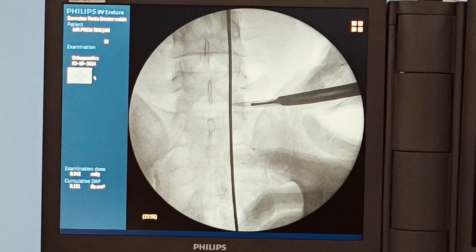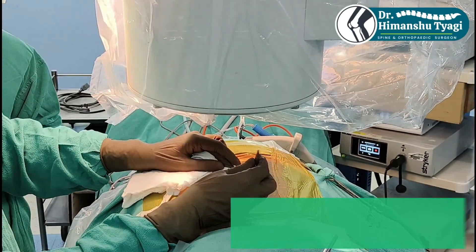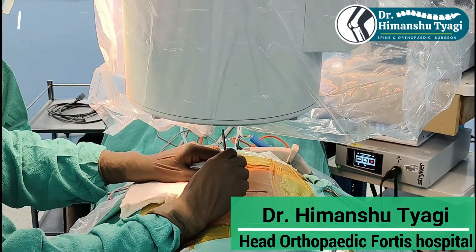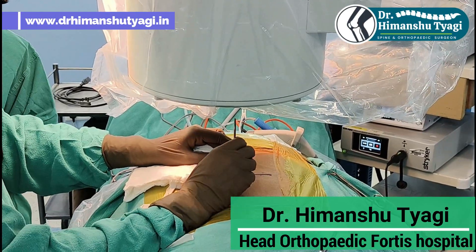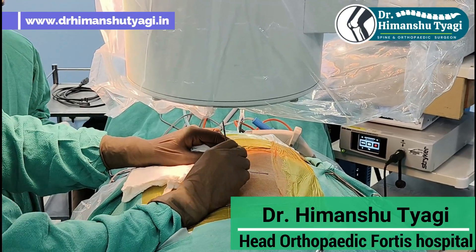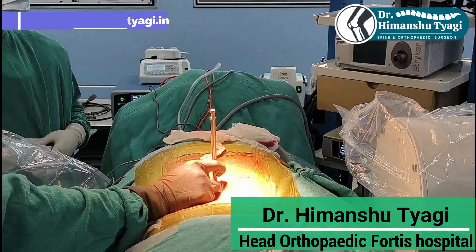First we mark the level where we have to do the surgery. Then we give a small incision which is almost 7 mm in size — almost the size of a fingernail. Through that incision we put serial dilators.